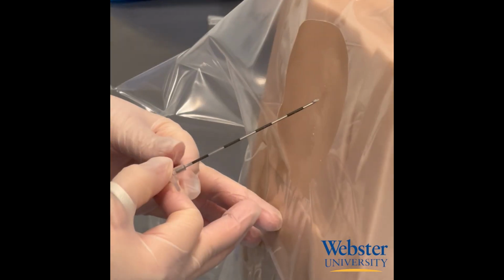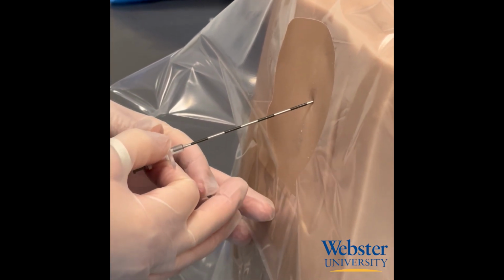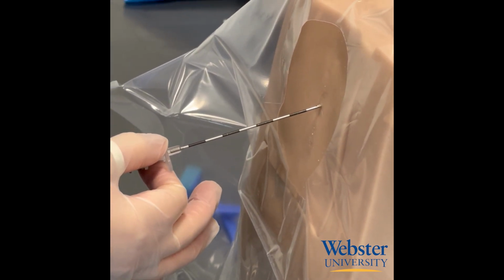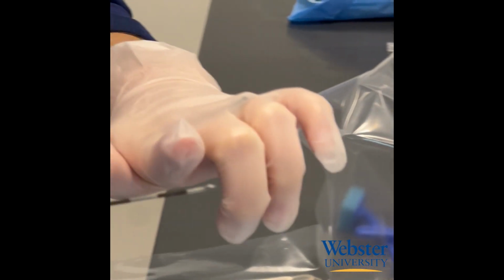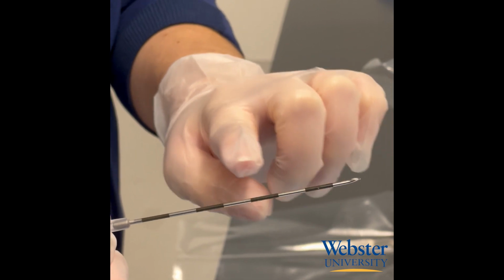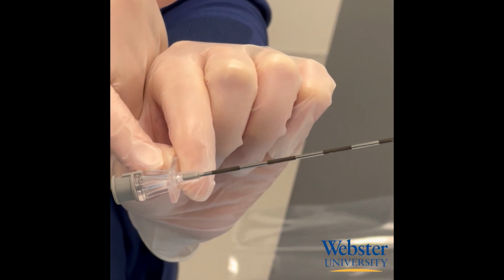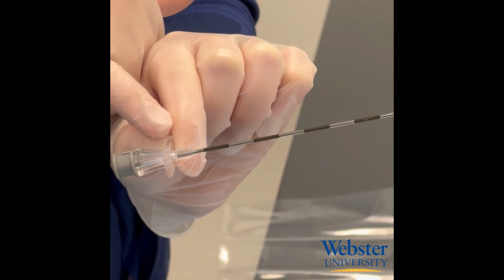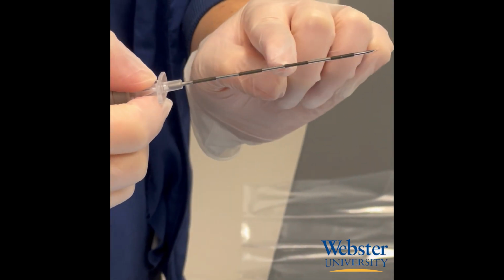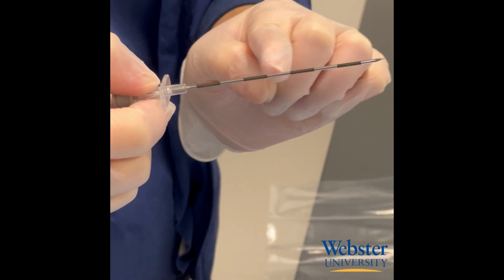The average distance from the skin to the epidural space is 4 to 6 centimeters. So each of these markings on the epidural needle is 1 centimeter. So here we have 1, 2, 3, 4, 5, 6, 7, 8, 9. And then this little window here is where you can see the catheter when it's inserted and is going to be the 10 centimeter mark. So the average distance is 4, 5, 6 centimeters to the epidural space, so the needle should be inserted until about here.